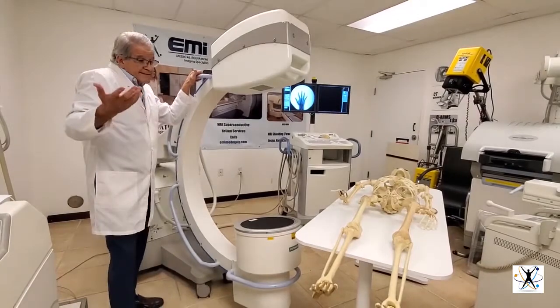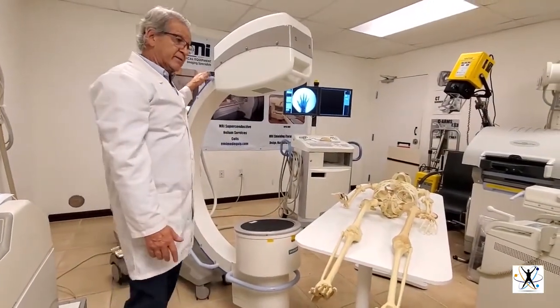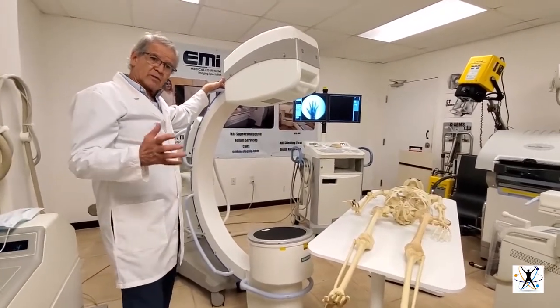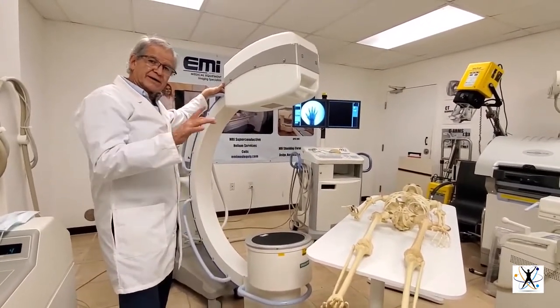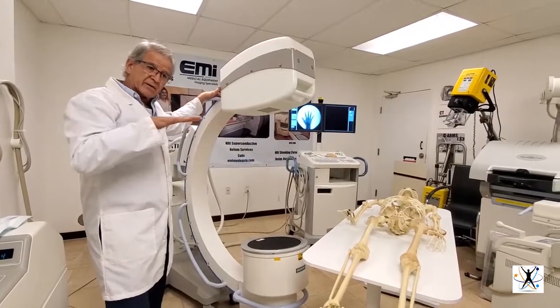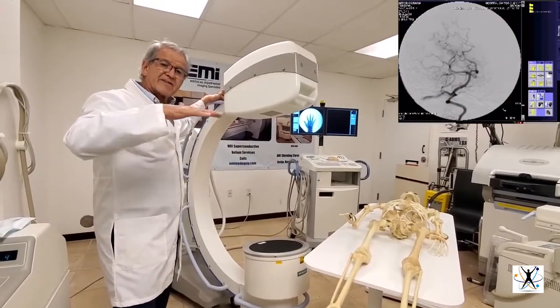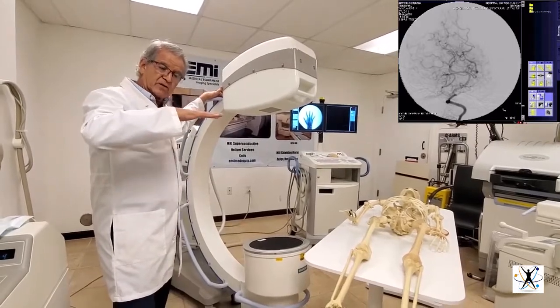This is the function for the SCR. We are going to do some studies to show how you see the fluoroscopy. Fluoroscopy is X-rays like video — constant X-rays.